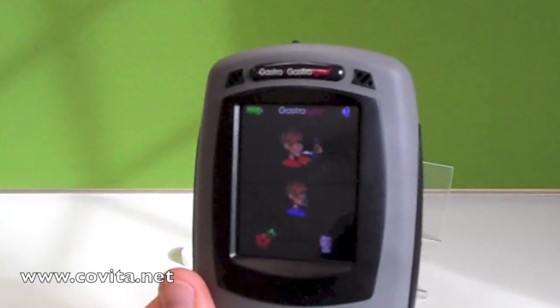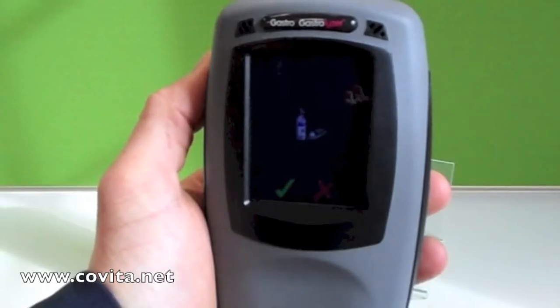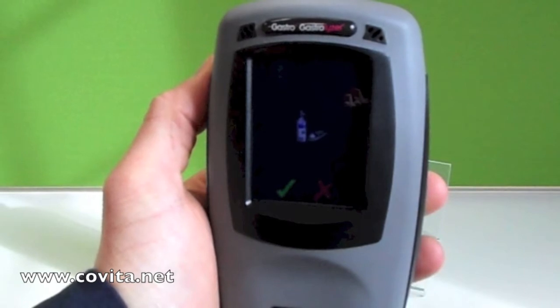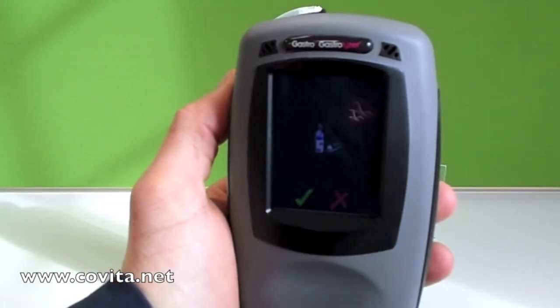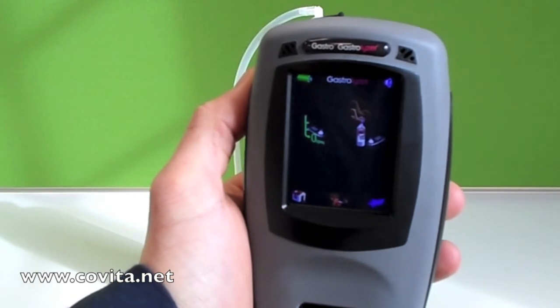Please note, on occasion you may not see the home screen when booting up — you will see the calibration reminder screen instead. This happens every 30 days and is a reminder to calibrate to correct for sensor drift. From the calibration reminder screen, simply touch the green check mark to continue.